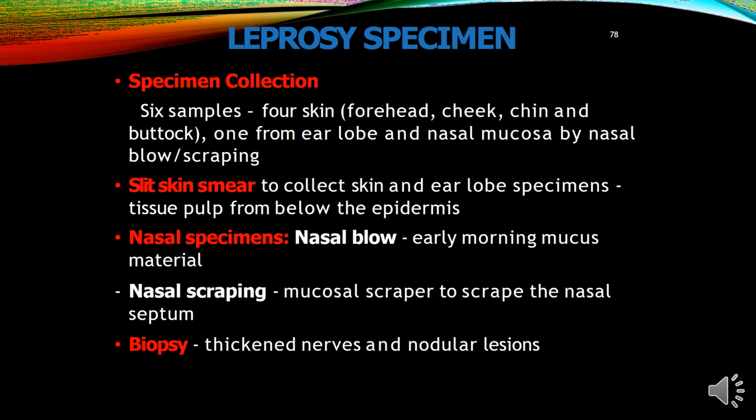In case of leprosy specimens, take 4 skin samples from the forehead, cheek, chin and buttock. One from the earlobe and the nasal mucosa by nasal blow or scraping.